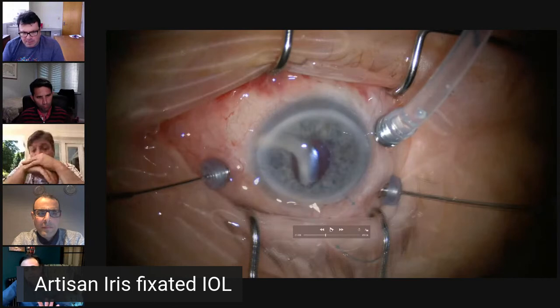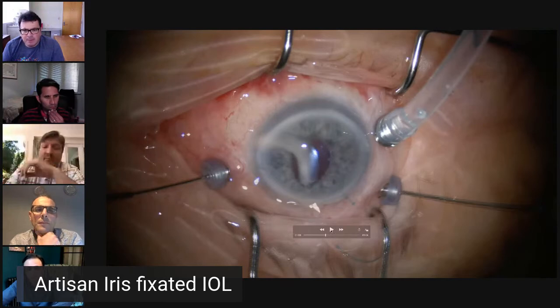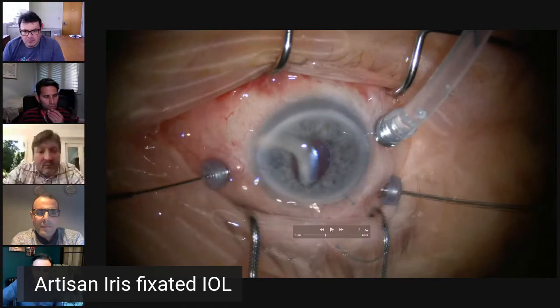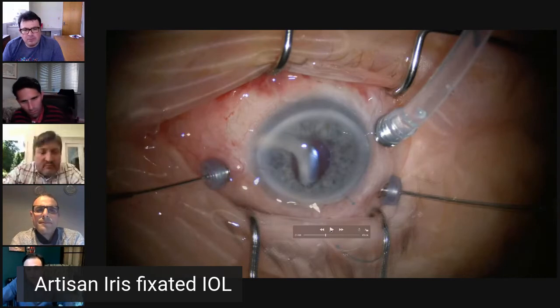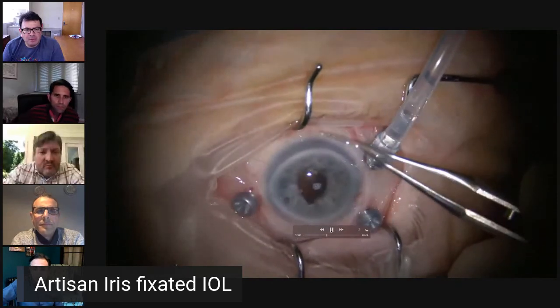And this is also making your life difficult. So that's why I put Healon in as much as possible and do minimal manipulation, and I keep the infusion off at this stage while I'm trying to externalize the intraocular lens. Once I have a stable anterior chamber again, like now, I tend to put the infusion back on. Yeah, good point. Lens is out, and now I'm going to introduce a posterior artisan lens.